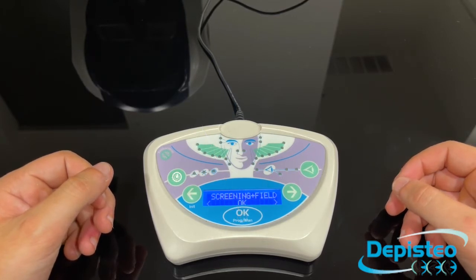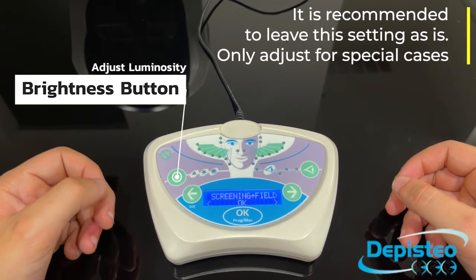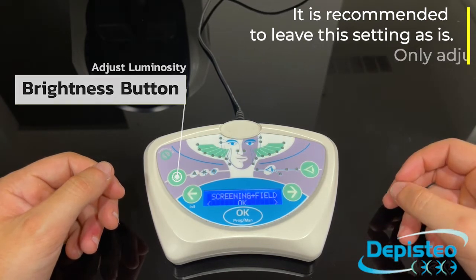The brightness button lets you adjust the brightness of the test you're currently performing. Please note that it is recommended to leave the brightness as is unless your patient is susceptible to high brightness. On some tests, the brightness setting will be locked.